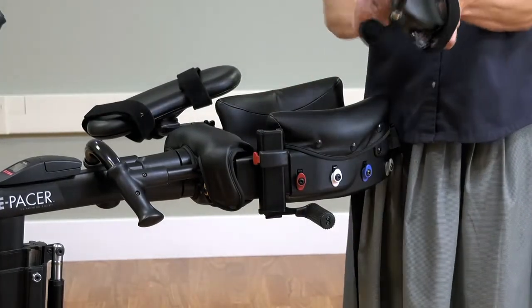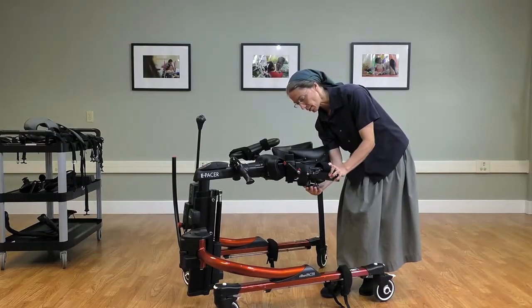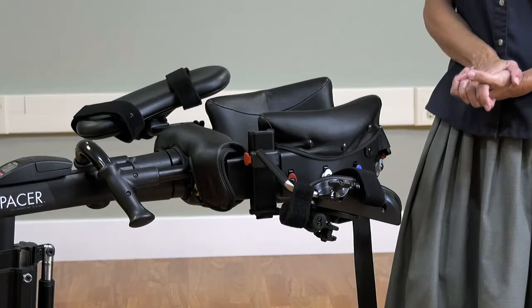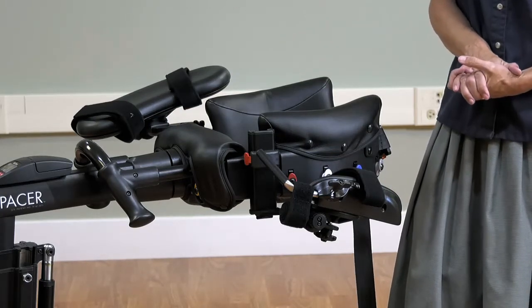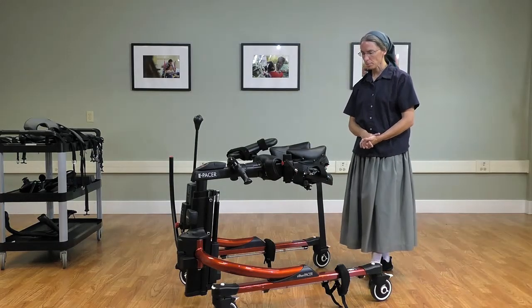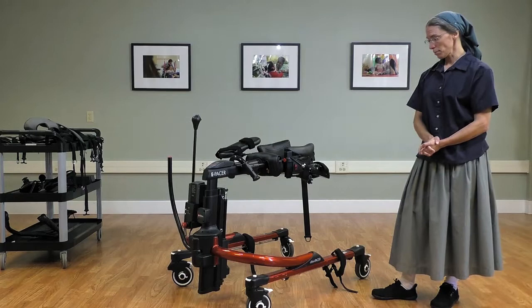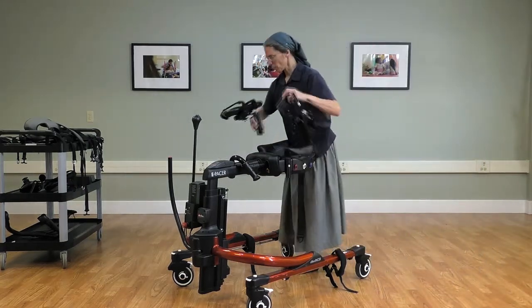We can slide the arm prompt under the platform and position it farther back to vary that arm position, which will enable you to assist positioning for the student.